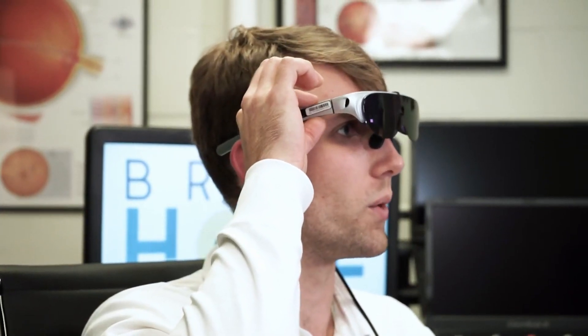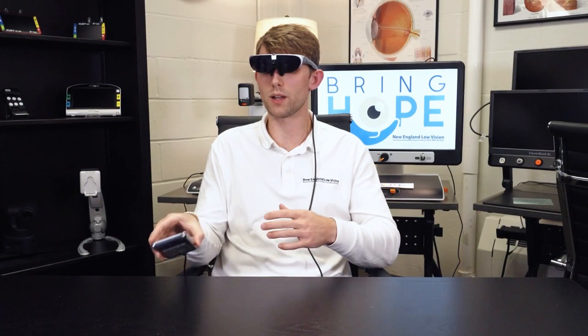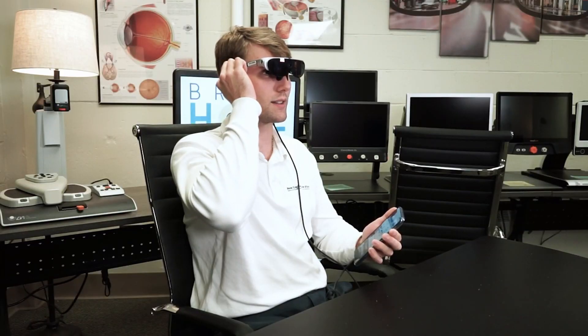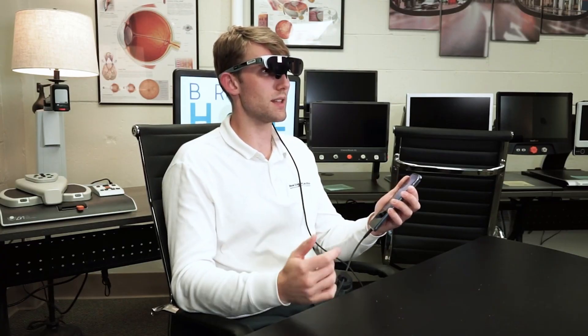To utilize this AI assistant, I'm going to activate a button up here on the top of the glasses. When I press this in, it's going to take a picture and you will hear a shutter sound. Once the picture is taken, it will not say anything audibly unless I want it to. I'm going to press the button on the phone right above the power button and use this like a walkie-talkie, holding it down and saying a command.